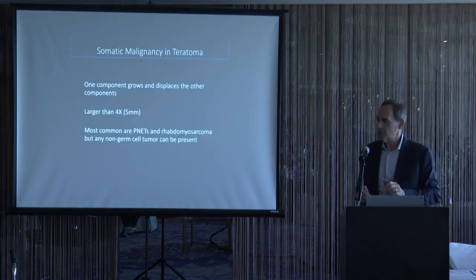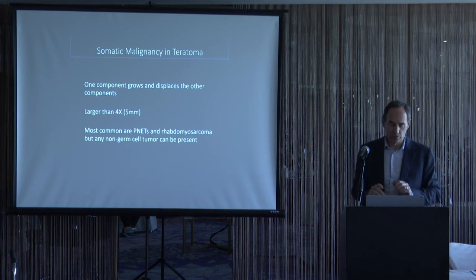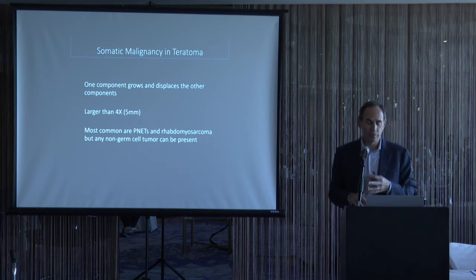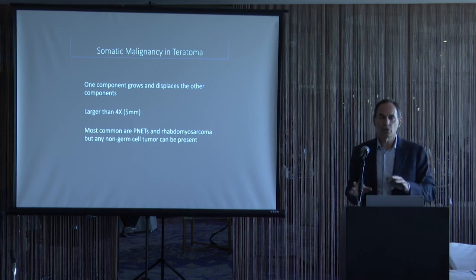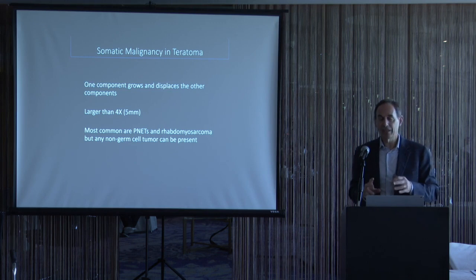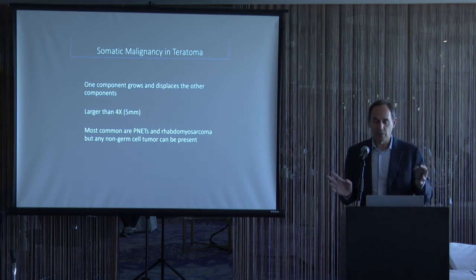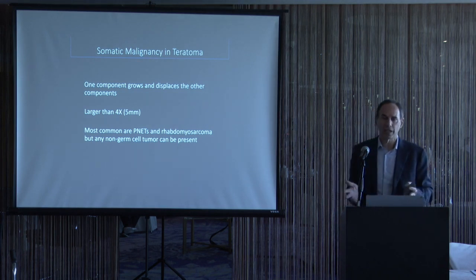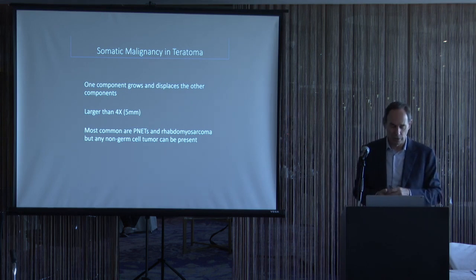In contrast, somatic malignancy in a teratoma is when you have one of the components, it could be epithelial or mesenchymal, where it outgrows and displaces the other components of the teratoma. And the latest WHO definition is greater than 5 millimeters. The older definition was larger than a 4x field. They both translate to basically the same, so for the most part, you can use either one.